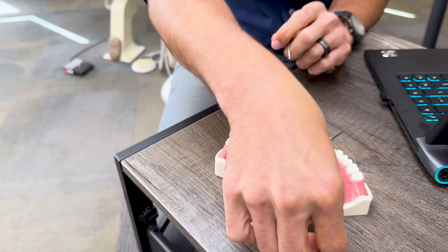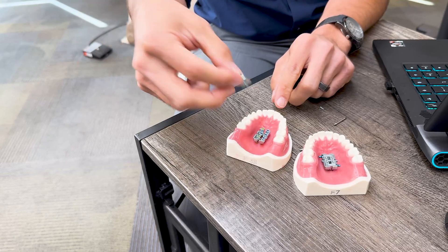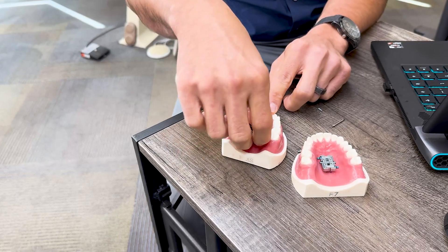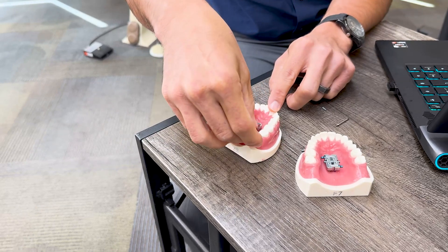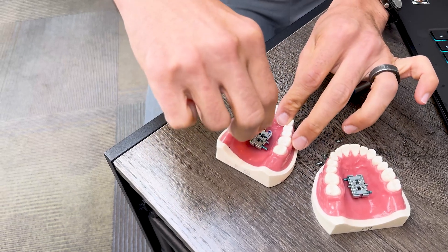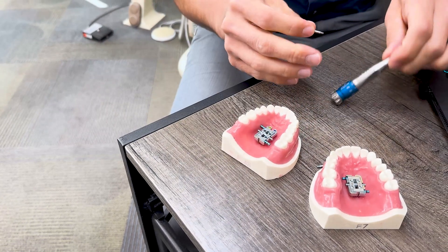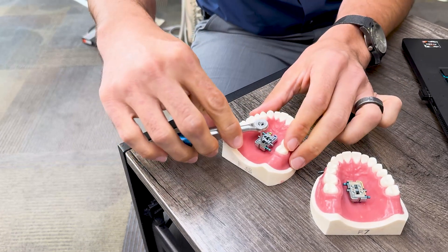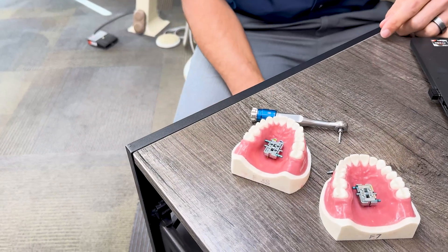Then you put the screw in. This part doesn't need a guide because everything's already in — the guides are used to place the anchor bodies. Once that's placed, you'll want to make sure you don't place it backwards, otherwise they'll have to turn from bottom to top instead of top to bottom. Once it's in, place the retaining screws and lock those in — these torque to 40 newton-centimeters because it's metal on metal so it's a little tighter. Crank up to 40 newton-centimeters and lock it in — beautiful. I always loved that click on a torque wrench; it's satisfying.